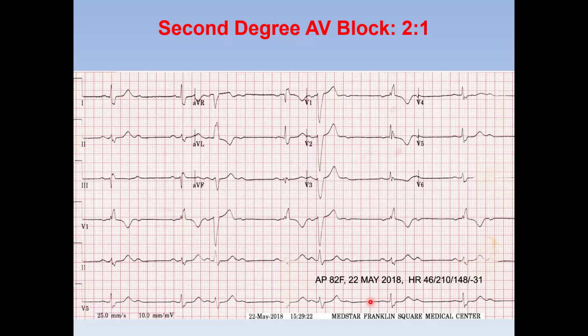A lot of times, patients come with pre-existing right bundle, 2:1 AV block, or even complete heart block with a good escape rate. We don't put a temporary pacemaker in. We just put a permanent one the same day or next morning. But this is the kind of patient that, if I have to wait, I'll put a temporary pacemaker in, if the patient has a history of syncope.